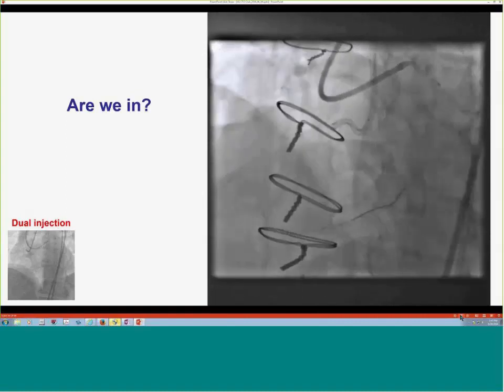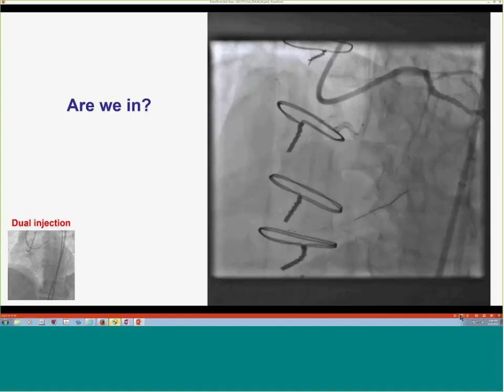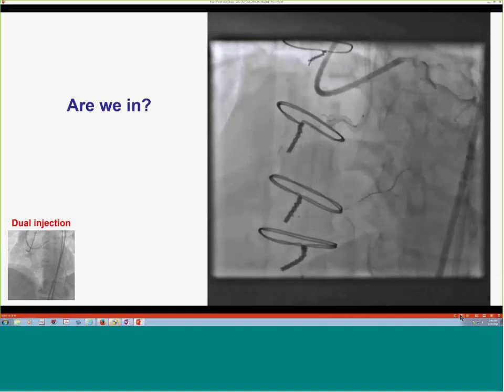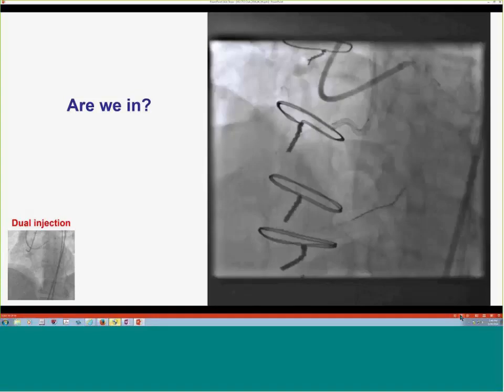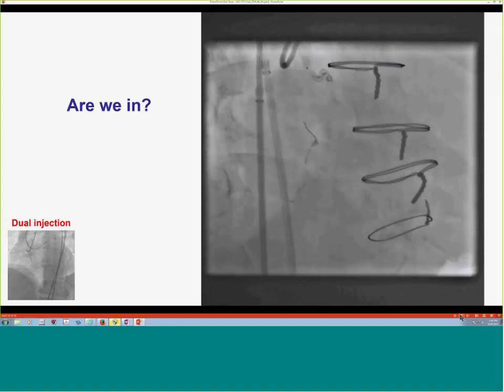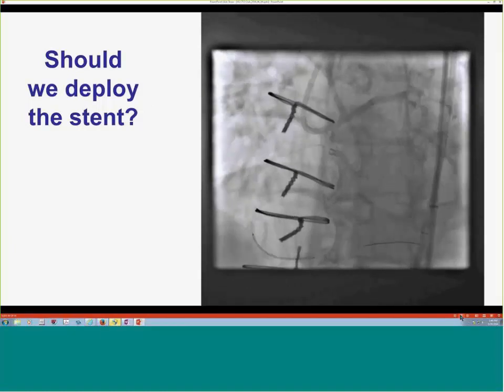Well, the wire, do you feel good about the distal position? It just looked a little funny, and again, may not project perfectly, but it looked to me like the wire is not perfectly in the vessel. In some views, in some frames, I can see the wire kind of being next to the vessel lumen. To my eyes, what I can see here is it's next to the vessel after the Stingray, all the way up to almost a distal branch. That may just be one of those things that in another view wouldn't even be there. So most of it's subintimal for sure. Yeah, I think that was a concern. That's another view, just to confirm it. And I think you're right. I think we have true lumen in the very distal PLV, the very small distal branch. But in the more proximal part, we're subintimal. And although we were very tempted, we almost got a stent down there, like, well, let's stent it, we'll take care of it. We didn't do it.